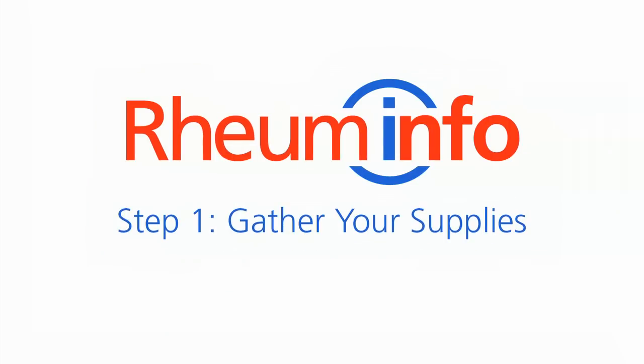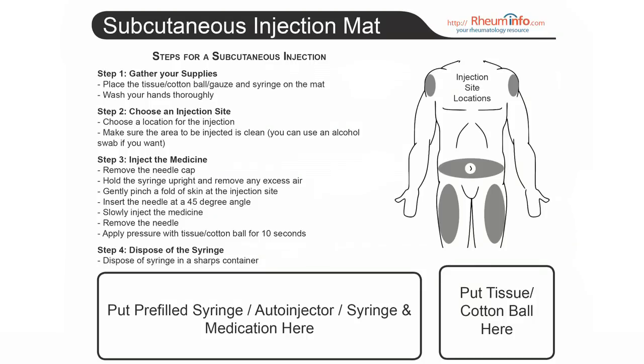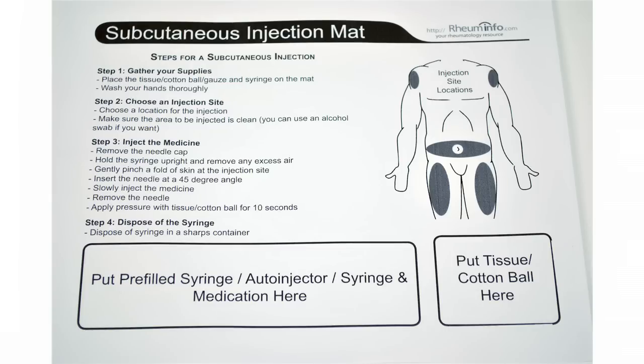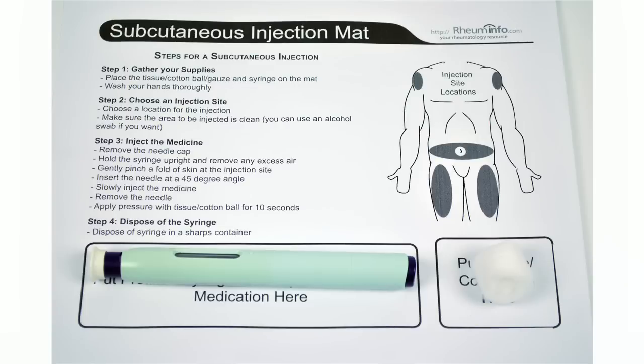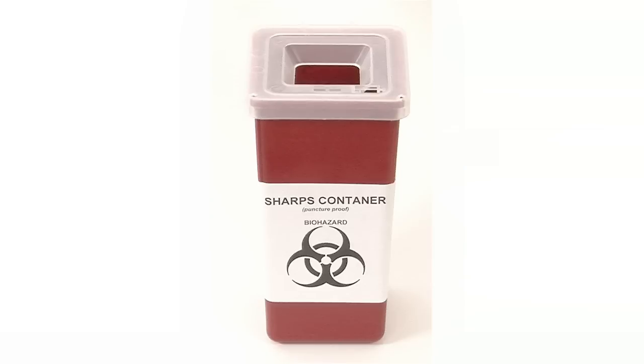Step one, gather your supplies. At roominfo.com, we've prepared a special injection placemat. This will help to make sure you've got all of the necessary supplies. Place your injection mat on a clean table or surface. You'll need your auto-injector. If it has been in the refrigerator, it's a good idea to let it warm up for about 30 minutes. If you're not sure, talk to your doctor or pharmacist. You'll also need a clean gauze or tissue, and finally, a puncture-proof sharps container to dispose of the used auto-injector. If you're missing any of the supplies, talk to your local pharmacist.